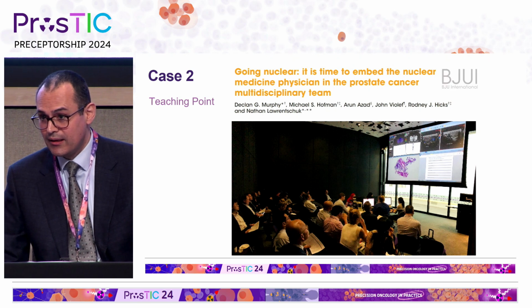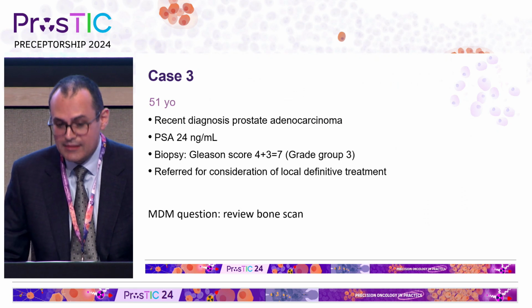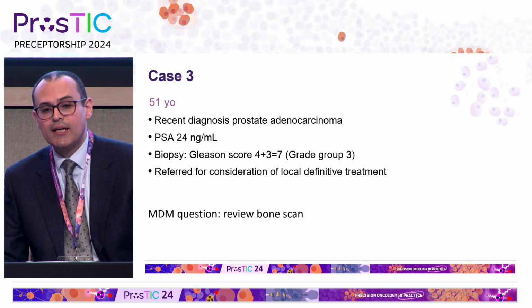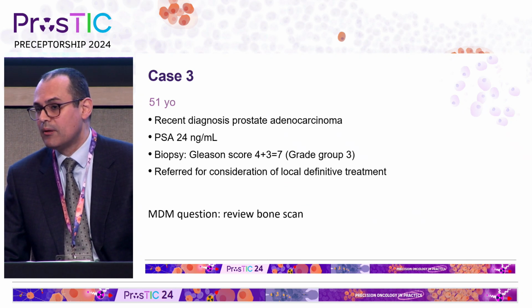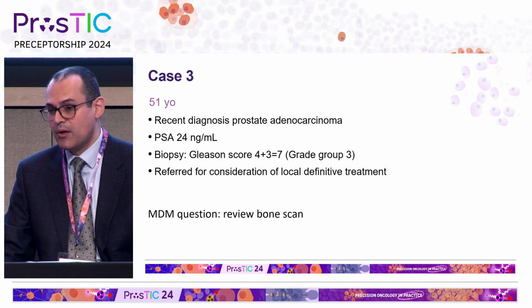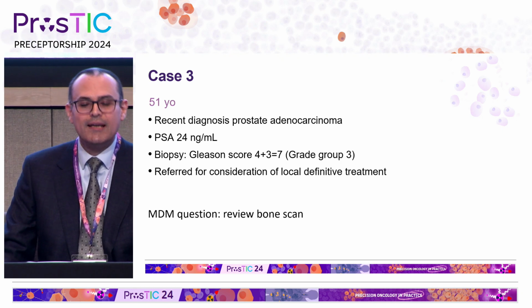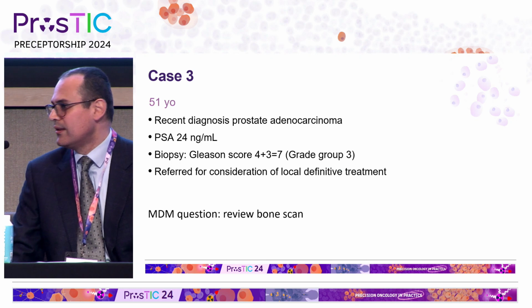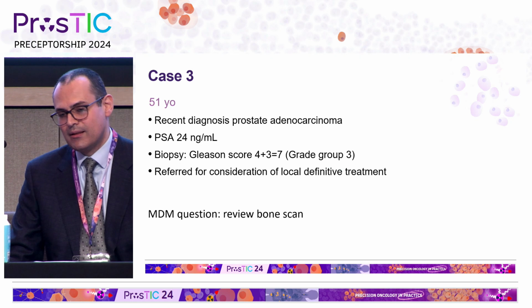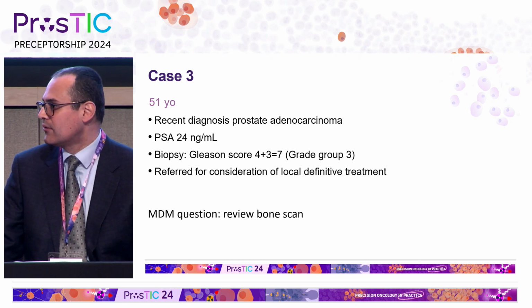Just one other point that can be helpful, for pelvic bone lesions, if the patient's had an MRI prostate with a diffusion sequence, some data, not particularly robust data, but data nevertheless, suggests that there's more than 90% agreement between positive DWI and positive PSMA PET CT for metastasis, as opposed to degenerative geodes, which is actually often the most common thing. So in the pelvis, if it's subchondral, if it's up against the joint, you should be saying, why isn't this a degenerative geode? If it's not up against the joint, then unfortunately, if you have an MR, it's worth having a look, and it may help.